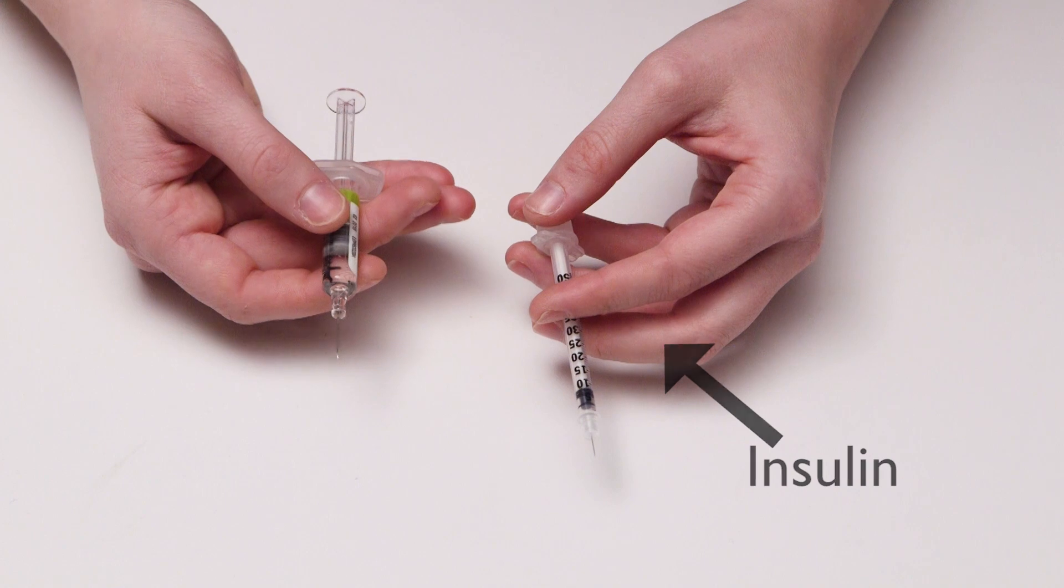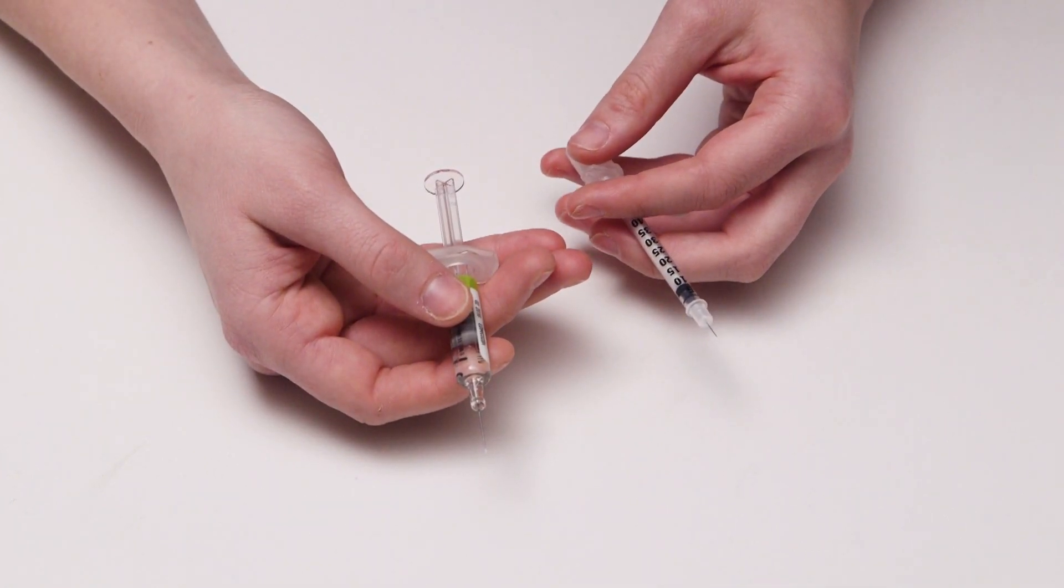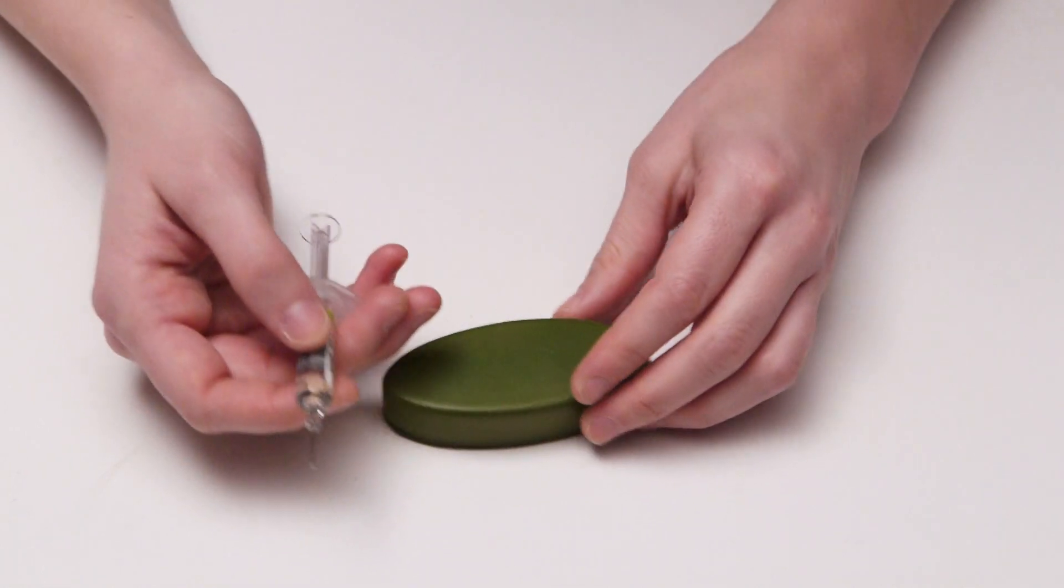Unlike an insulin injection, the glucagon injection is an intramuscular injection, much like epinephrine. This means that you have to use some force when giving the injection.